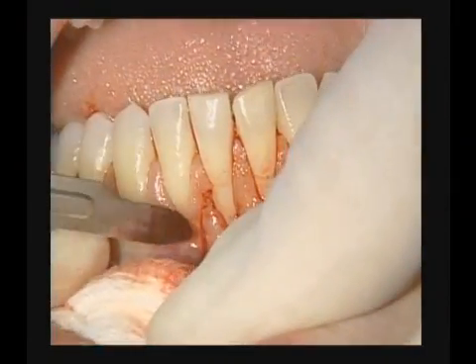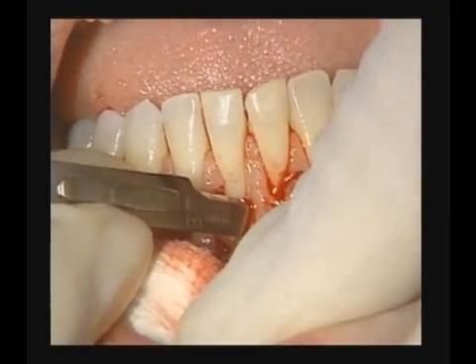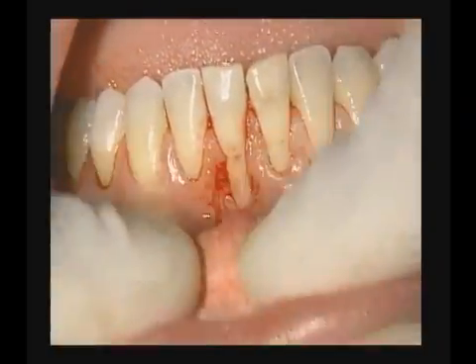And now we will extend underneath the tissue between the two teeth, the papilla with sharp dissection, but we don't want to raise that or separate it from the underlying bed.